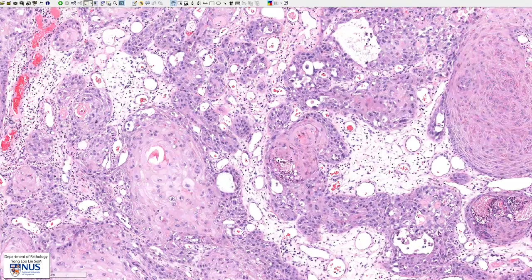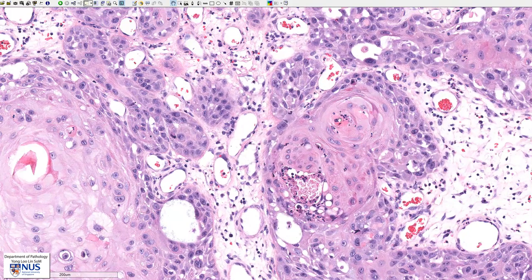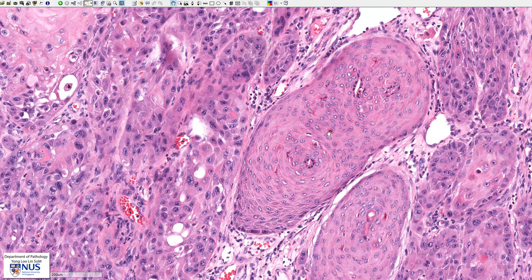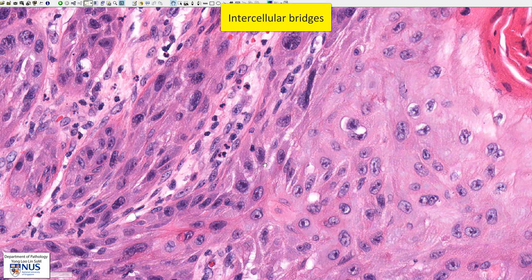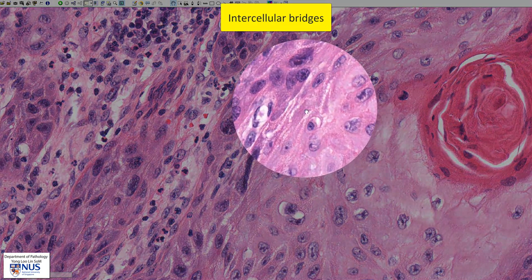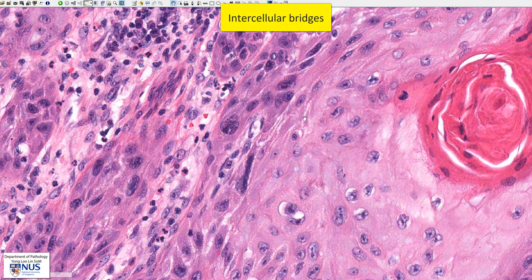Sometimes we may instead see single cell keratinization, such as these single cells with very dense orange cytoplasm. Here are more examples of single cell keratinization. Another feature of squamous differentiation is the presence of intercellular bridges, and for this we have to look at very high magnification to the space between adjacent cells. Here we can see them very clearly — they look like little finger-like bridges between adjacent cells. These intercellular bridges are also a feature of squamous differentiation.